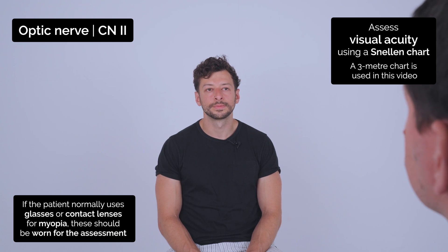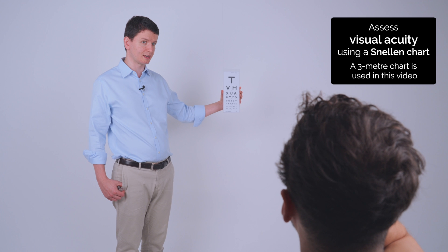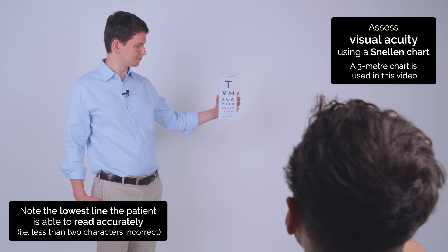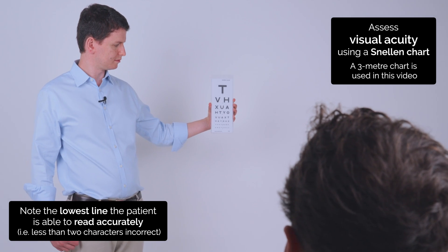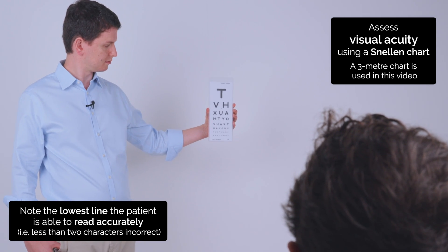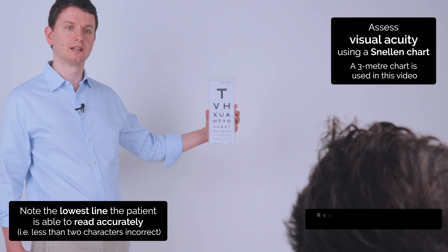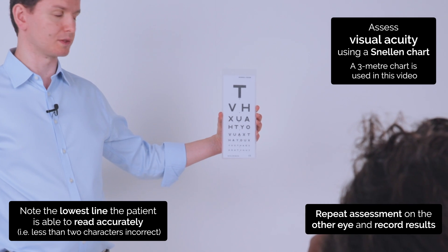Can you cover your right eye for me? Can you read down to the lowest line that you're able to? T-V-H-X-U-A-H-T-Y-O-V-U-A-X-T. Excellent. Now if you can cover your other eye and just read down to the lowest line that you're able to.